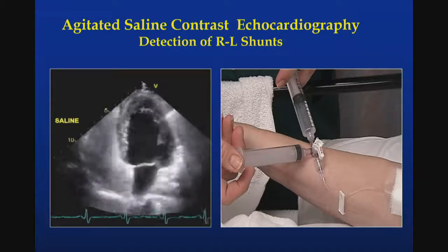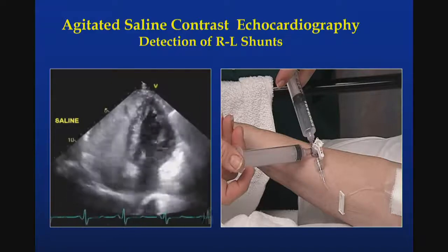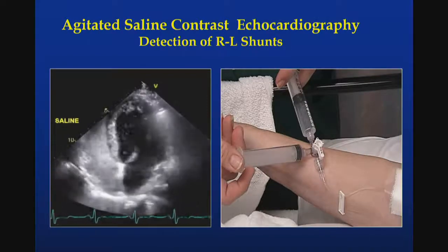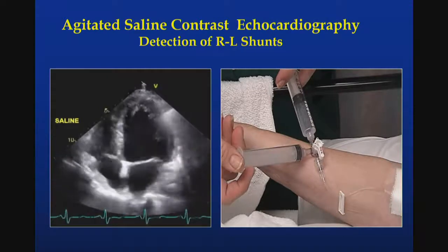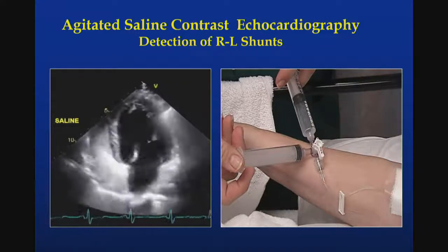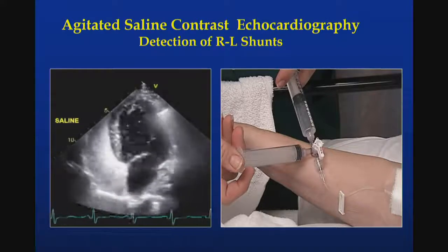I would stress again that this is really the preferred way, because you can have a Valsalva maneuver in the best of circumstances, not during a transesophageal echocardiogram. There, the transesophageal echocardiogram is to identify the localization of it and the shape of the patent foramen ovale and exclude other entities, just like a small atrial septal defect or the like.